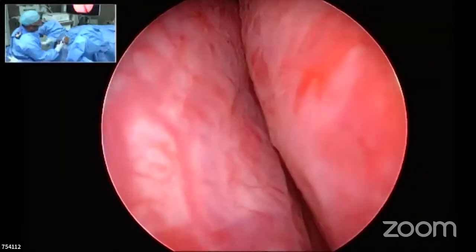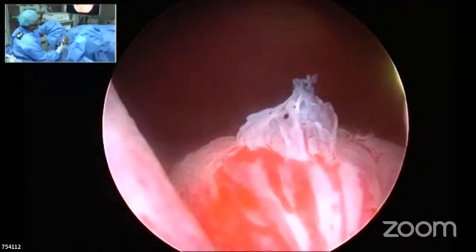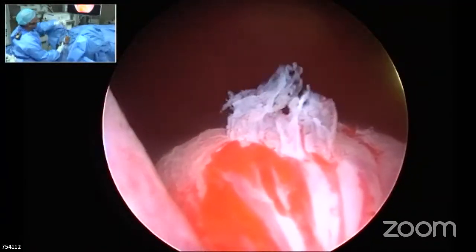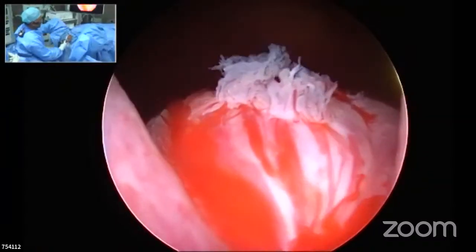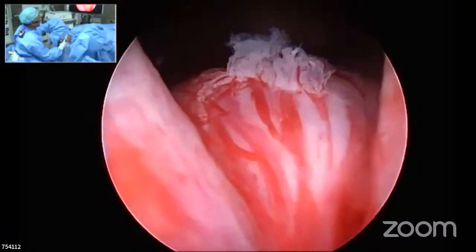And second thing is, I want this resectoscope, whenever I am putting it in a resting position, if this is the way it is seen, I don't want that. I want that thing to be heading down a little, so that it becomes more parallel as I work with, and that will be more ergonomical.